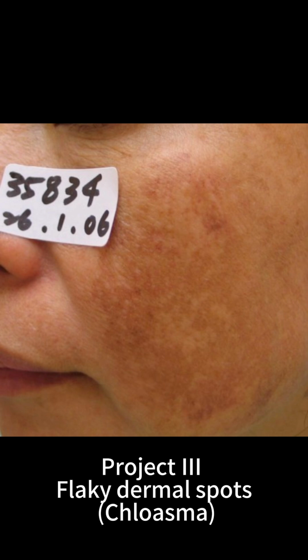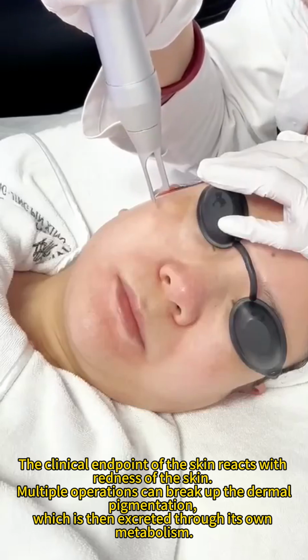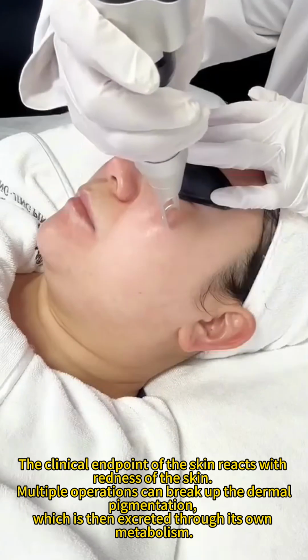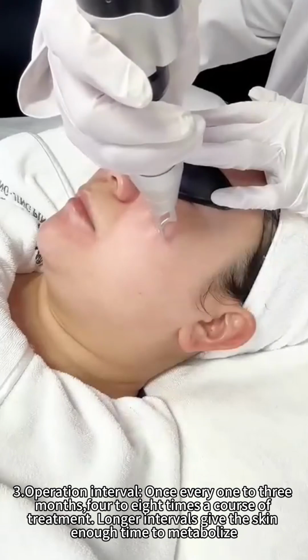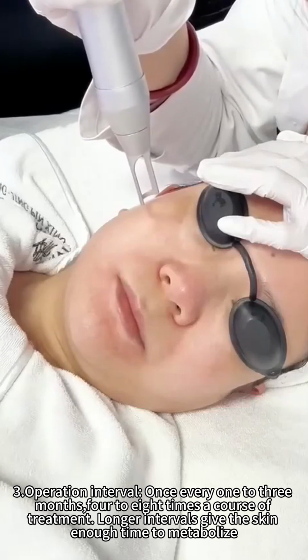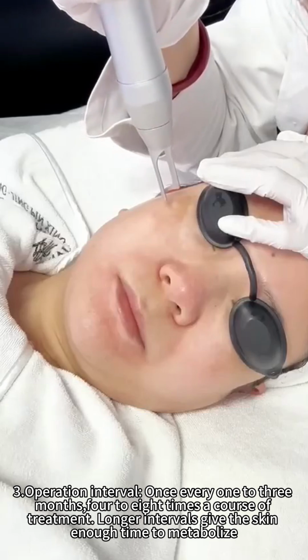Project 3, flaky dermal spots, chloasma. Recommended starting parameters: energy from 0.3, spot 6 to 7, frequency 5 to 6, wavelength 1064. The clinical endpoint of the skin reacts with redness of the skin. Multiple operations can break up the dermal pigmentation, which is then excreted through its own metabolism. Operation interval, once every 1 to 3 months, 4 to 8 times a course of treatment. Longer intervals give the skin enough time to metabolize.